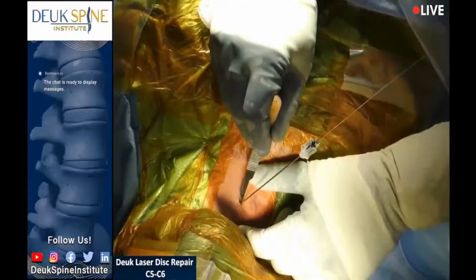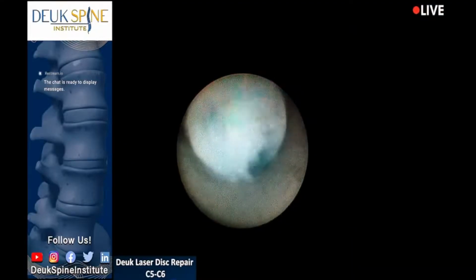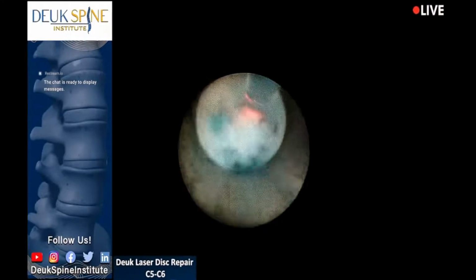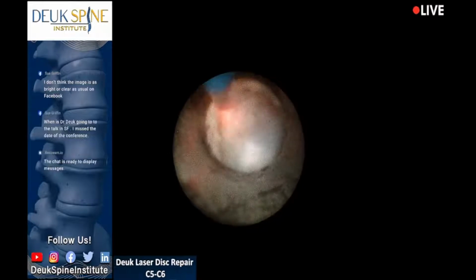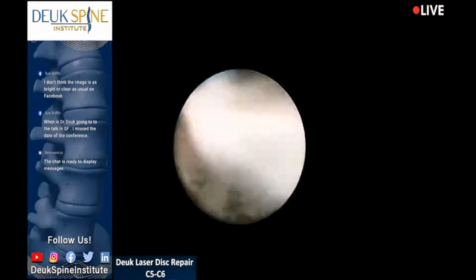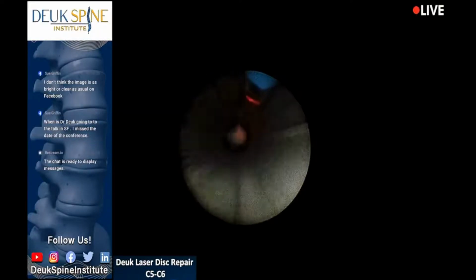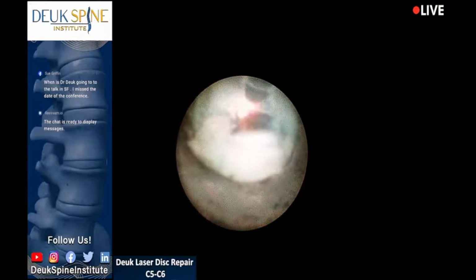Awesome. Can you show us your incision? Oh wow, look at that. So you have a 4mm incision. You can see that right here on the surgical footage of the endoscope. When you watch the video, you can see all the herniated discs back there. We were pulling them out one at a time. You had about 20 pieces. And then you can see the nerve root right there in the foramen. And there's no herniated discs anymore on the nerve root. We got them all out of there.